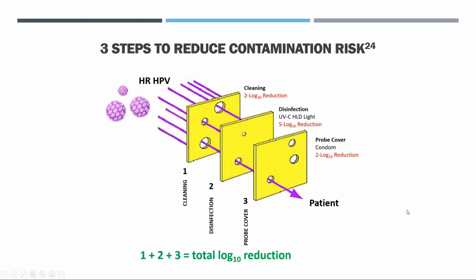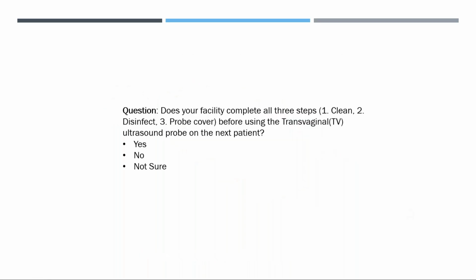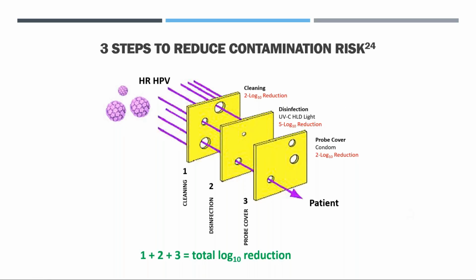So let me explain again. Another way of looking at it is this so-called, we'll go back down. This is called the Swiss cheese model of medical errors. And of course, as you know, in Swiss cheese, there are various holes in the cheese. In order to have a medical error in general, you have to have something that lines up with each hole, and you can prevent it by using various steps along the way.